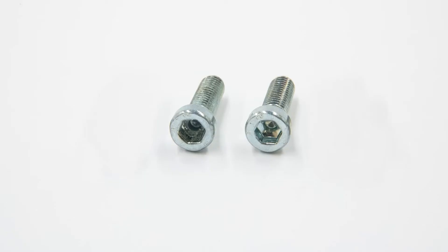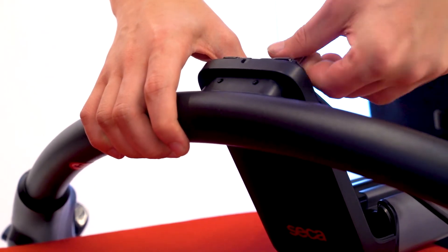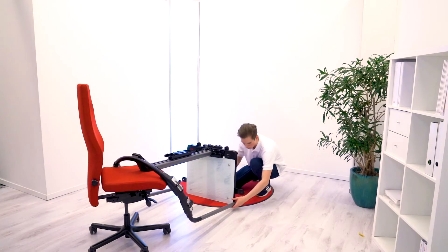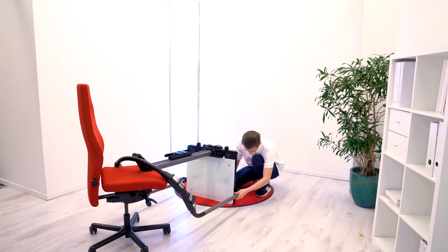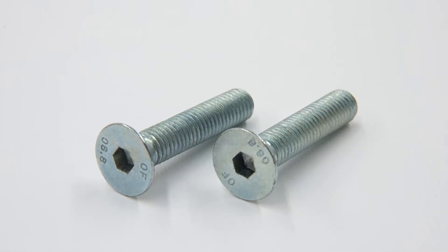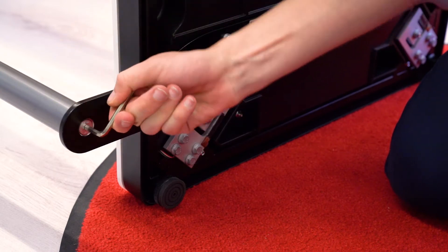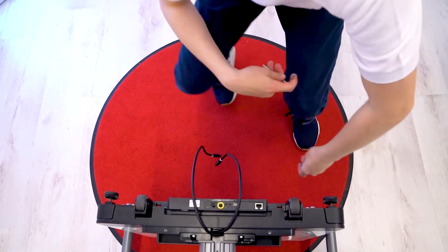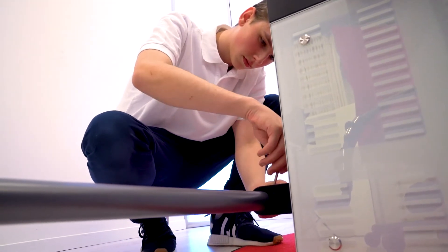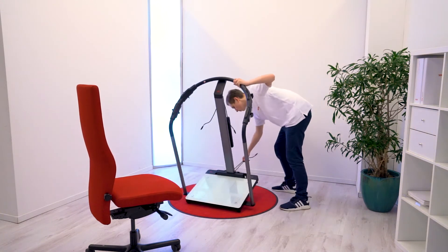Attach the railing to the handrail connector using the two M6x20 screws. Then attach the poles to the cross beam with the two M8x40 screws. Now you can tilt the device into its upright position.